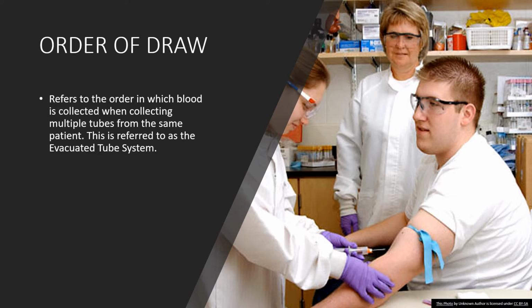You want to make sure that you use the proper phlebotomy drawing chair and make sure you lock the patient in so if they were to lose consciousness, they wouldn't fall. You want to make sure that you're polite, caring, and kind to your patient. But first, you must properly ID your patient.